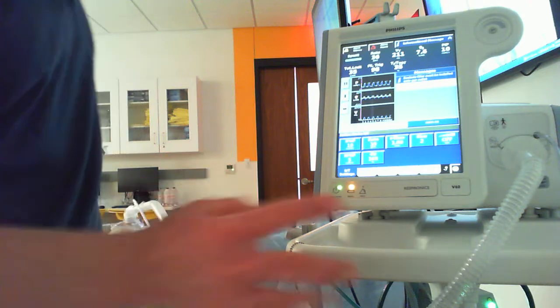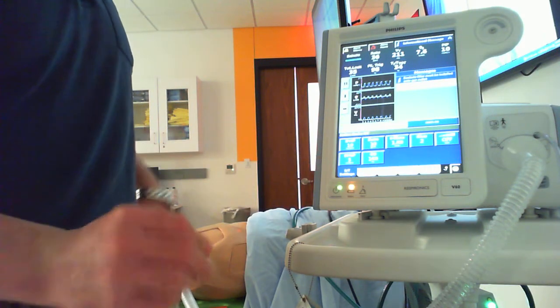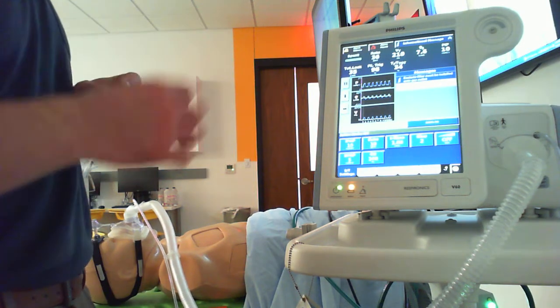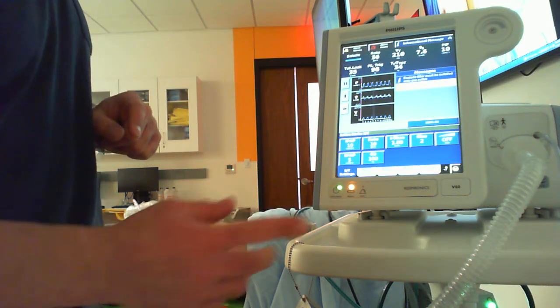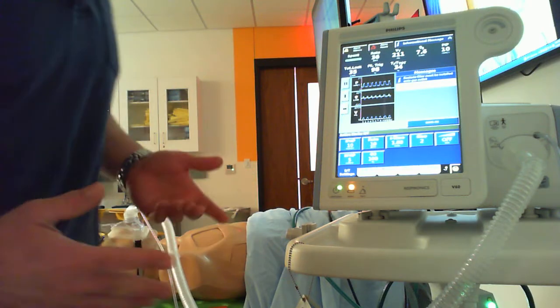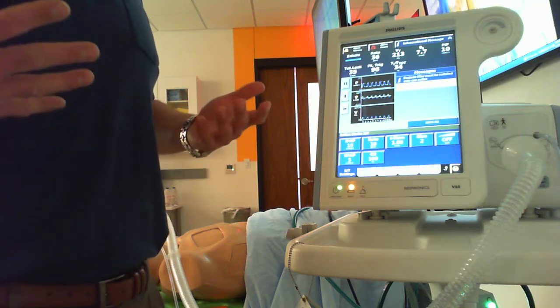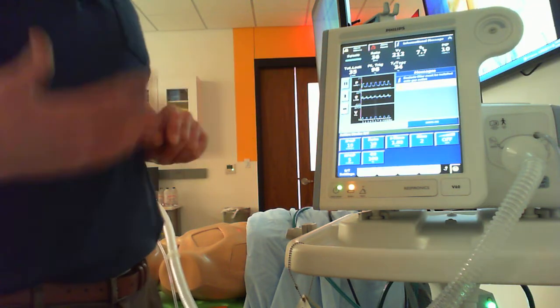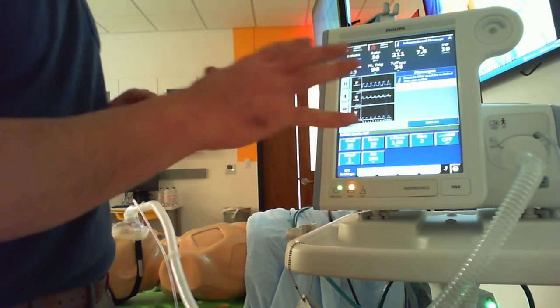So pressure support, or the difference between our inspiratory pressure and expiratory, is the amount of inspiratory assistance, or the amount of work the ventilator is applying to this patient's respiratory system. That level of pressure support is going to be responsible for our tidal volume here. It's going to be responsible for our patient's work of breathing, and our goal is to make this patient comfortable, okay? Our goal is to give them a little bit deeper breaths, and if they can breathe deeper, each of those breaths is going to be participating in more alveolar ventilation, and they're not going to have to breathe so fast when things go well, at least, okay?